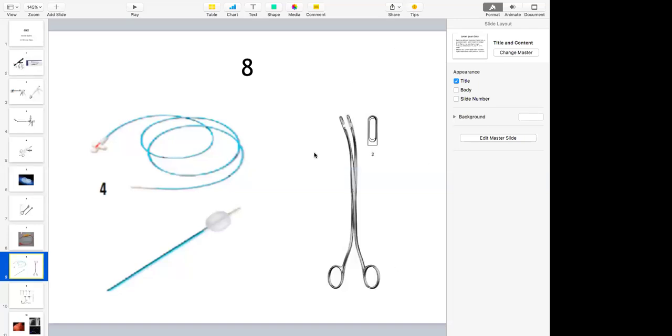Why do you say it is Desjardins? One or two basic questions like this will also be there. First of all, is there a catch or not? There is a ratchet, sir. No ratchet. Finger bows are there, the shaft is long and curved. And what do you have at the blade?